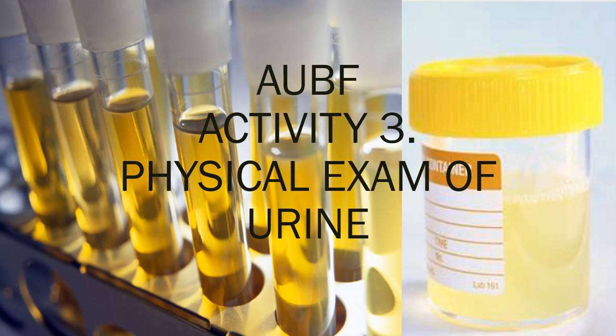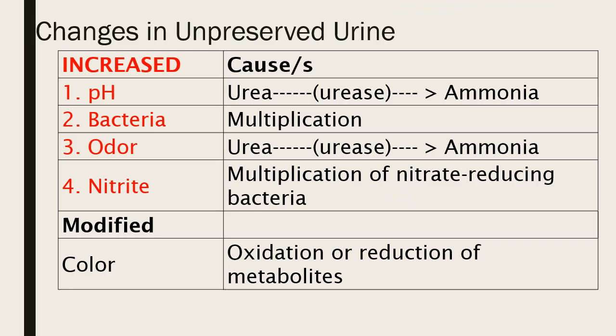Okay, and so your urine odor is still part of the physical exam, but it is not reported. It is not reported, but urine odor is somewhat valuable, because there are distinct odors that can help identify an underlying disease. So with this, let's take a look at your physical exam of urine.